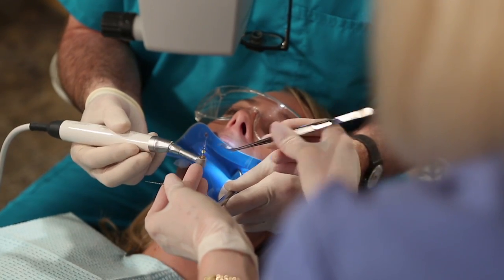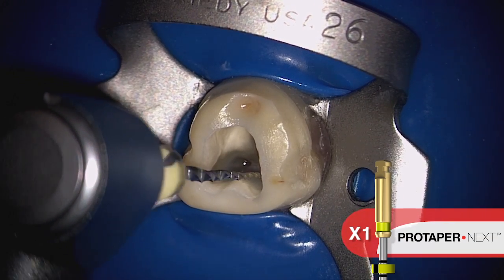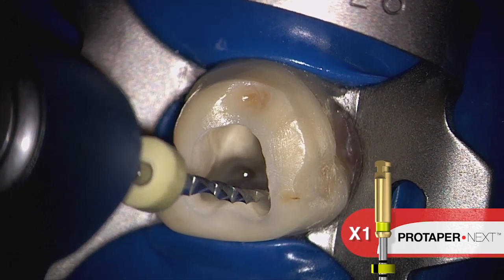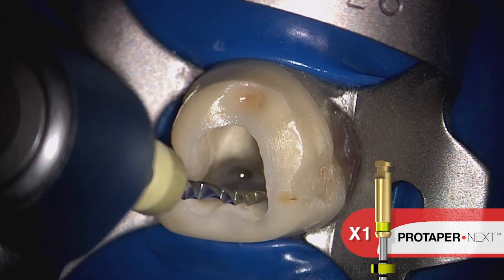Once we have a confirmed, reproducible glide path, we can commence shaping using the Protaper Next X1 file. Notice the swaggering, mechanical wave of motion along the active portion of the file. Notice that I'm brushing to make more contact between the instrument and the dentinal walls.